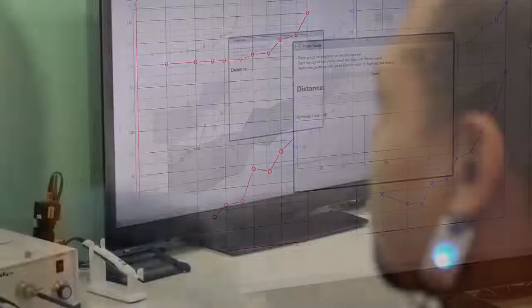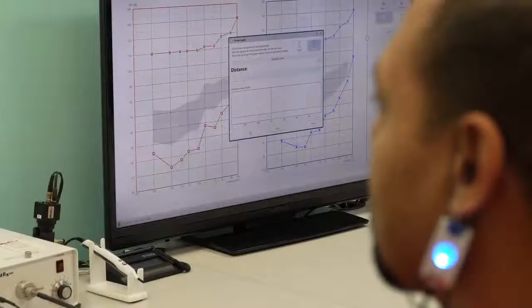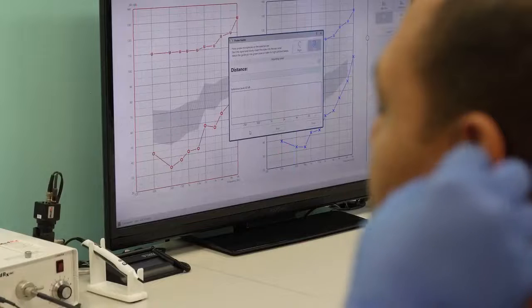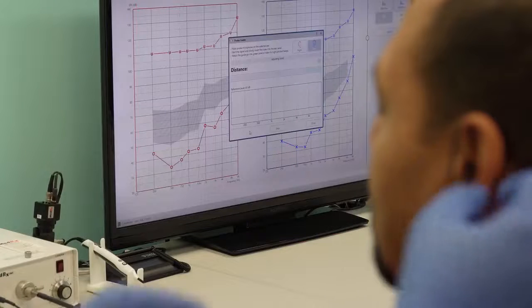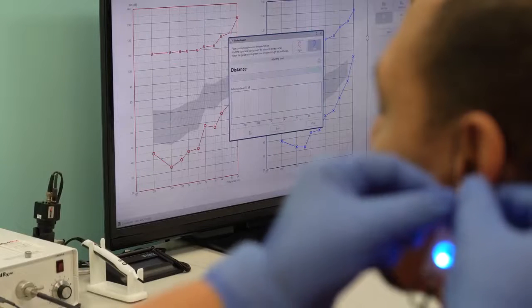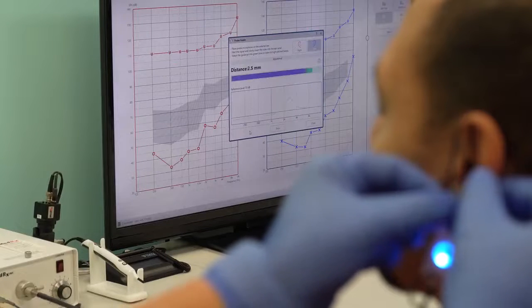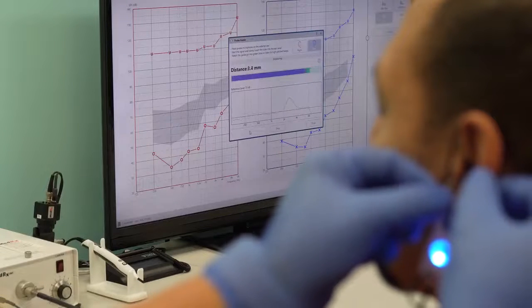The progress bar in this function will change from blue to green and an audible beep will play when the proper depth is reached.